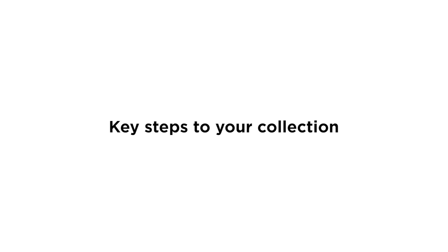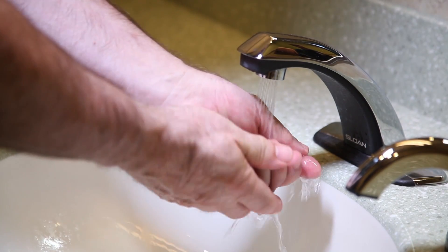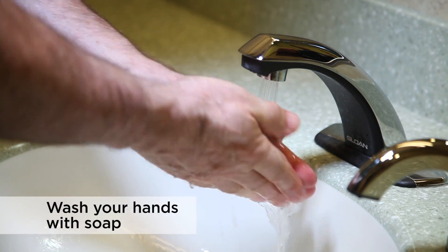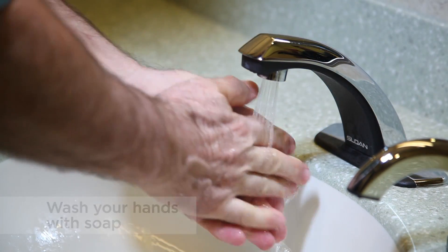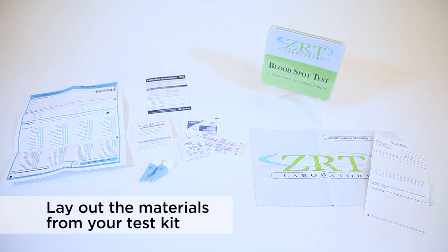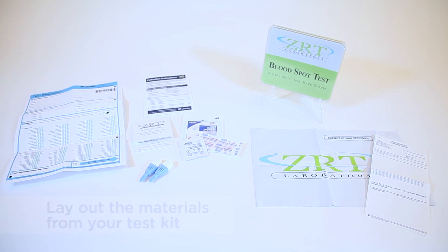Here are the key steps to a good collection. First, prior to handling the contents of the kit, wash your hands with soap and dry them with a clean towel. Next, lay out the materials that came in your test kit in the place you have selected to collect your blood spot samples.